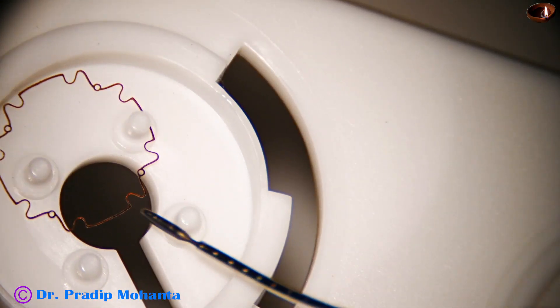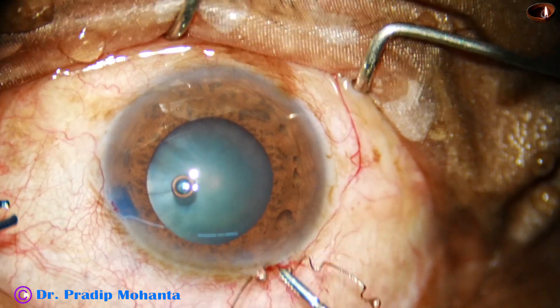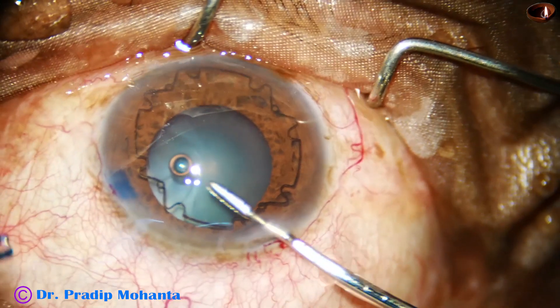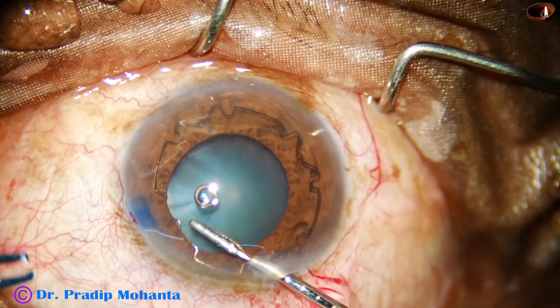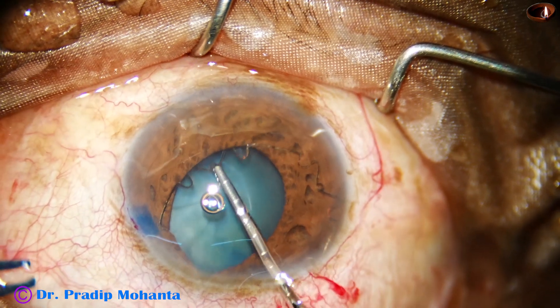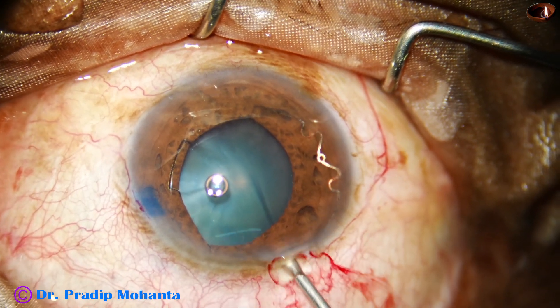It has 4 straight flanges and 4 curled flanges. Curled flanges give more expansion when necessary, especially in SICs. This device has been designed by my friend Dr. Subhan Bhattacharji especially for SICs, but for IFIS this is a very good device, better than any other device in my opinion.